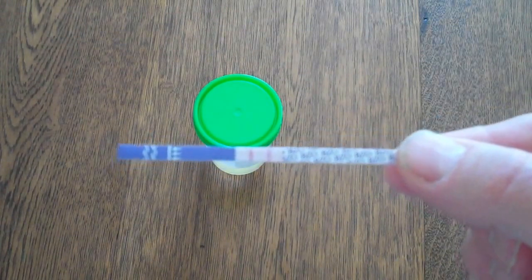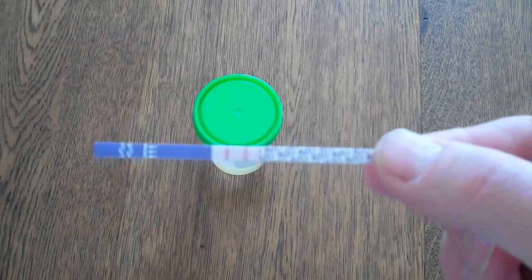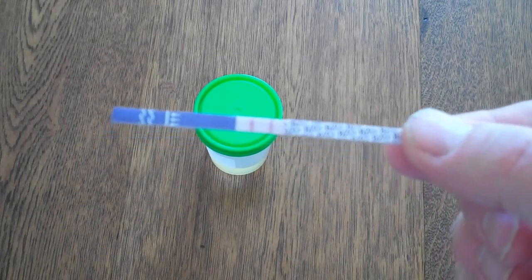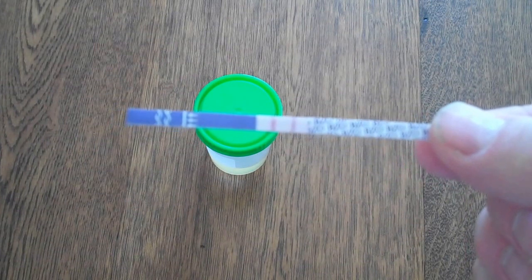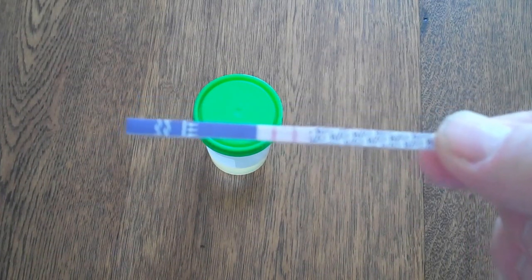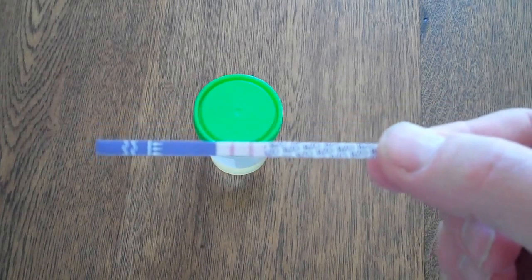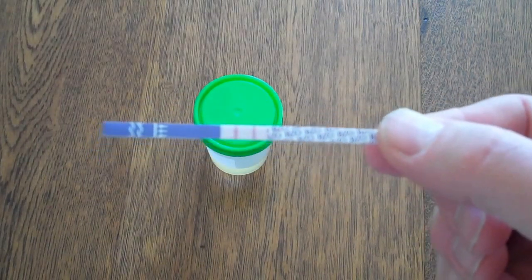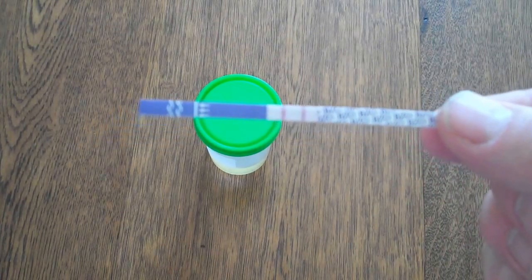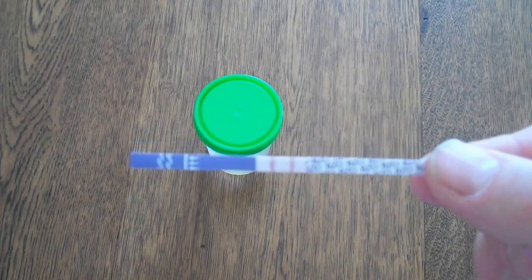So the interpretation of these results is dependent on the presence or absence of a test line. You must have a control line showing, and you can interpret this as a clear negative result because you've got both control and test line showing. Now there's no need to wait for the 5 to 10 minutes full development time on this. If you've got both lines clearly shown, you can interpret this as a clear negative result for benzodiazepines and move on to the next test.